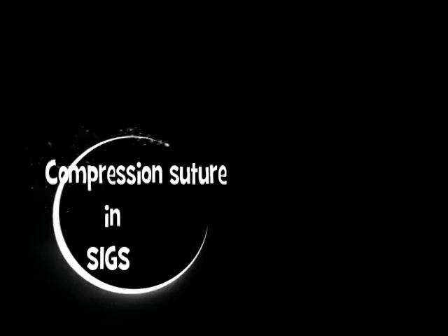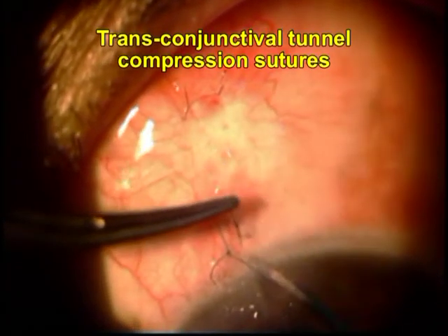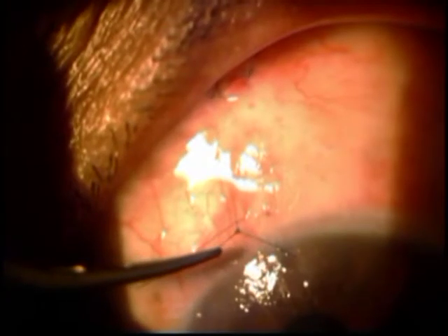Hi everyone, I'm Susan Jacob, and in this video I'm going to show you the removal of a compression suture that I had applied on the SIGS tunnel for a patient who had over-filtration on the table.